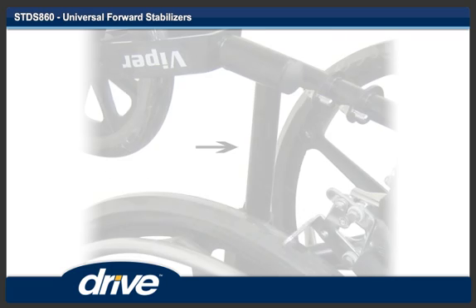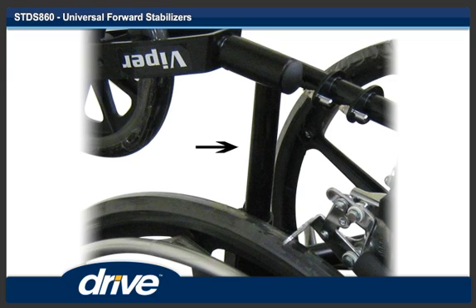Step 2. The front anti-tippers are installed on the lower side frame just behind the casters. The frame spacer is used on narrow diameter frames. Turn the wheelchair on its back and install the frame spacer if needed.